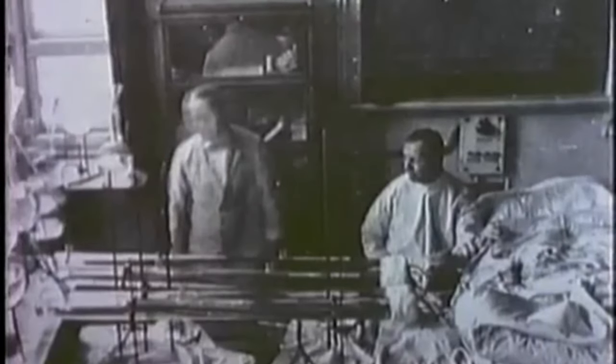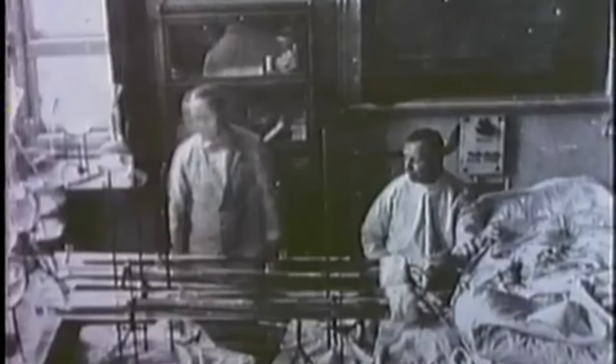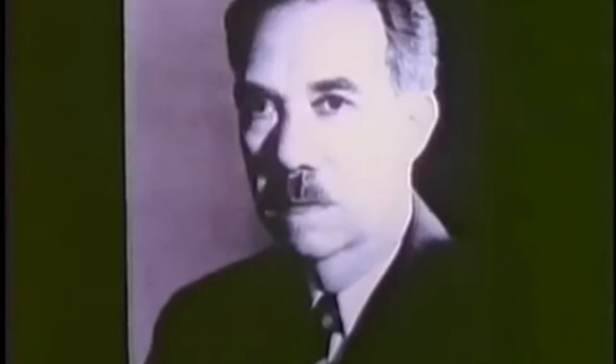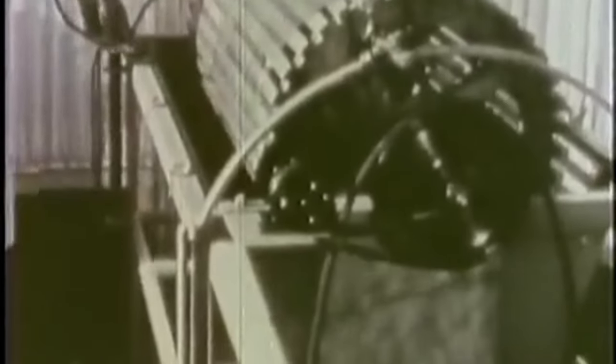Kolf came to the United States in the late 1940s and went to work at Mount Sinai Hospital, trying to get kidney treatment to become a health service. Because of the hospital's opposition to the type of therapy at the time, he and his colleagues conducted treatment at a separate site. More experimentation led to the manufacturing of an improved design in the early 1950s. However, Kolf's device only treated acute kidney failure and not end-stage renal disease, or ESRD.